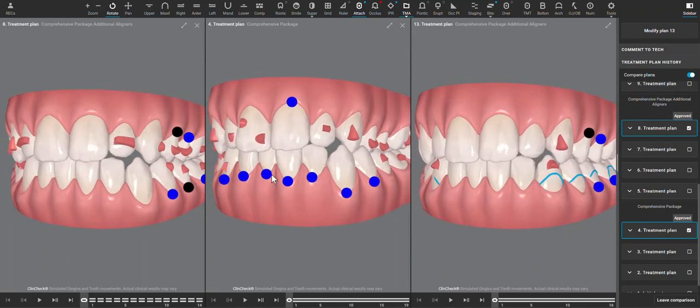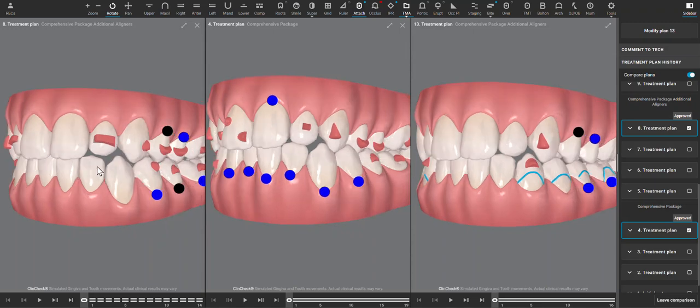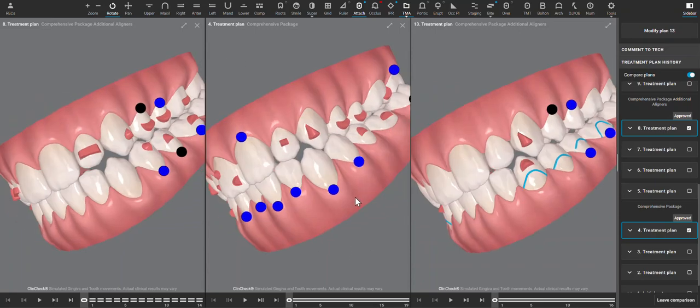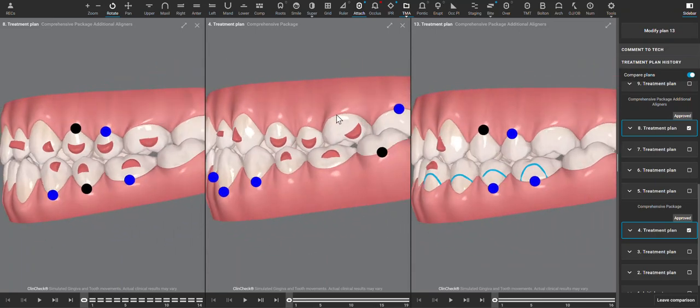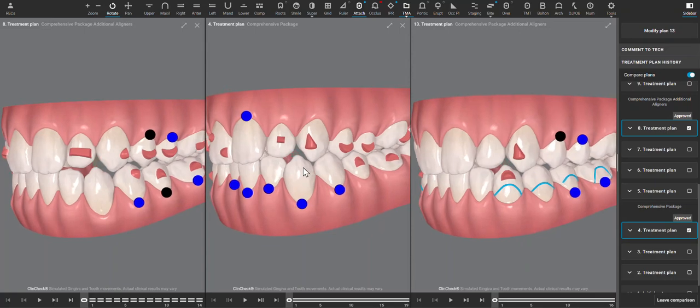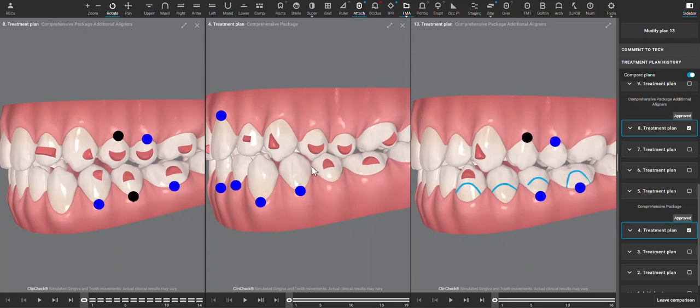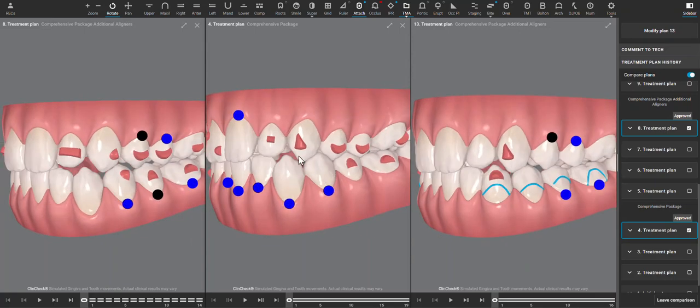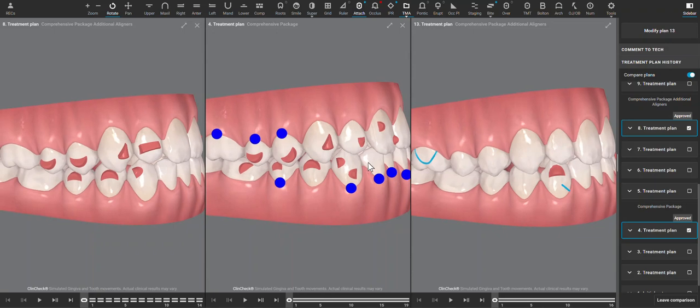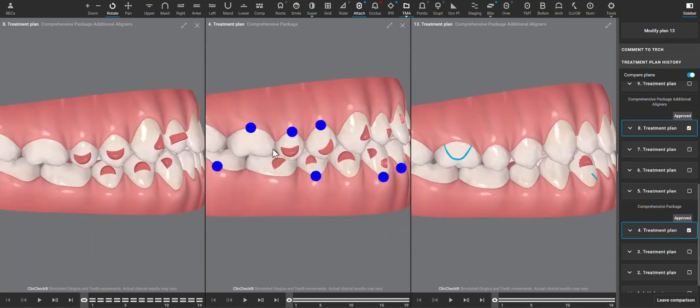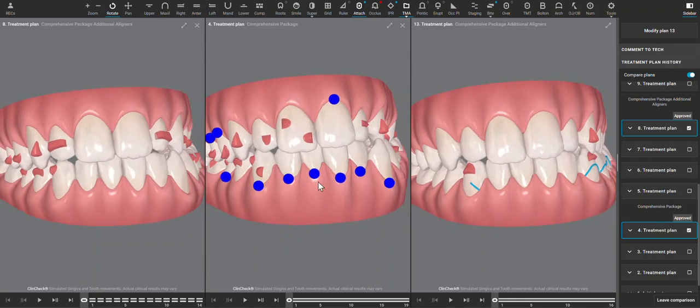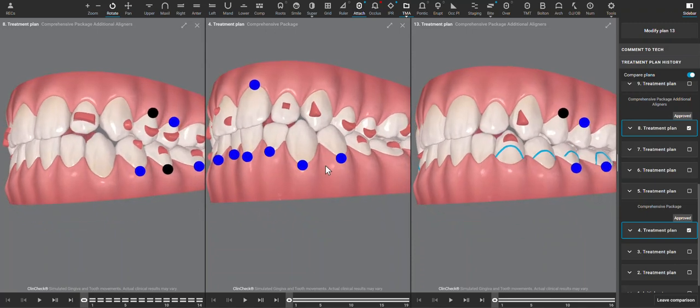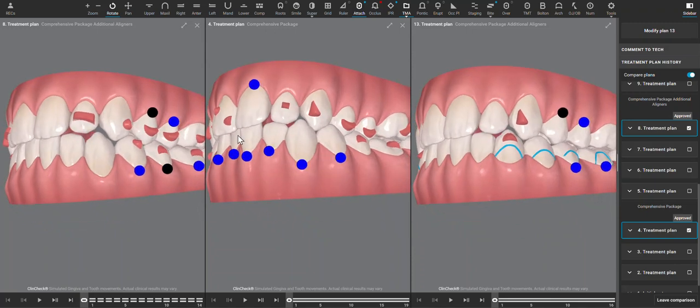And then any other additional aligners treatment plans. Looking at the initial presentation in the middle here, I can see that this patient is a Class 3. It's slight in the molars but even more so in the canines and Class 3 on the right hand side with some undersized laterals.